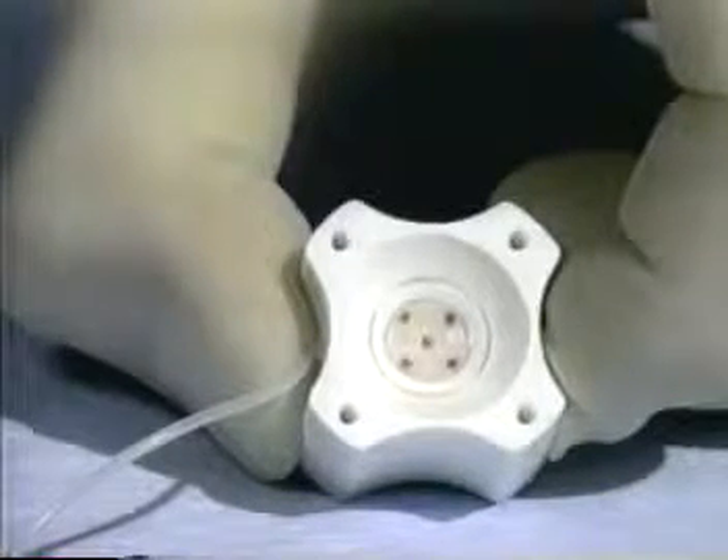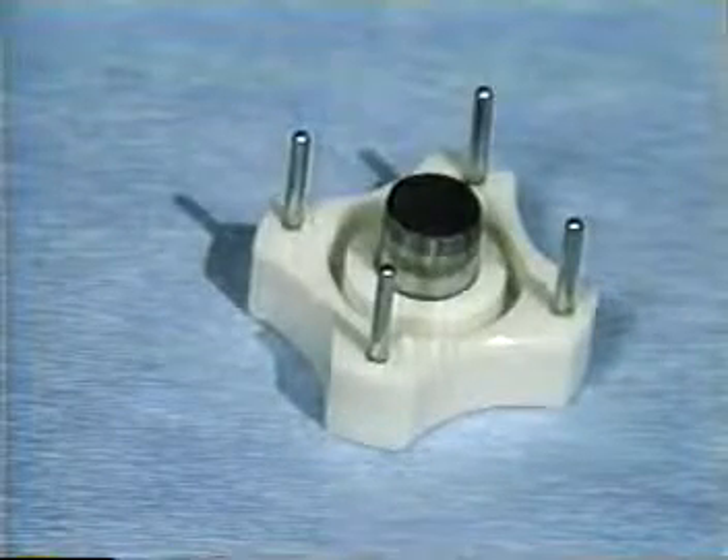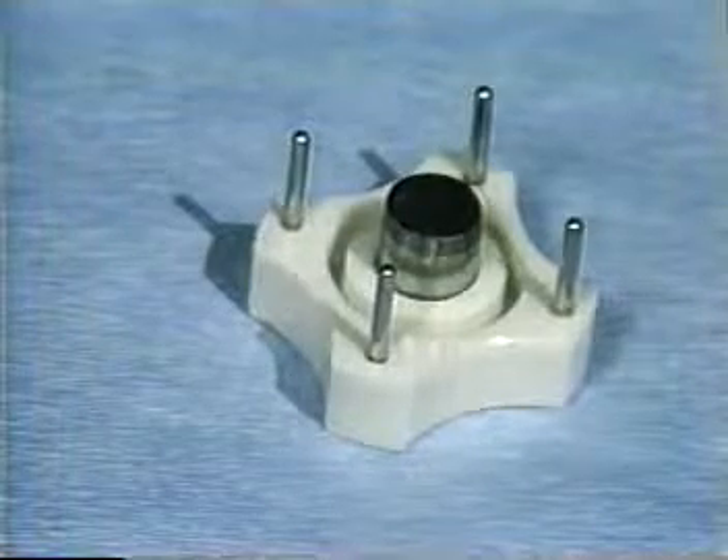The Barron Vacuum Donor Cornea Punch is available in diameters of 6 millimeters, 6½ to 9 millimeters in ¼ millimeter increments, and 9½ millimeters.